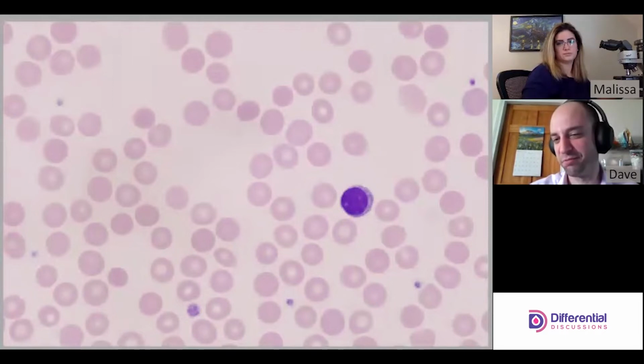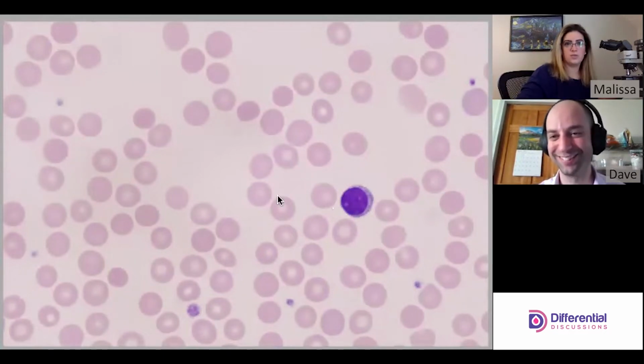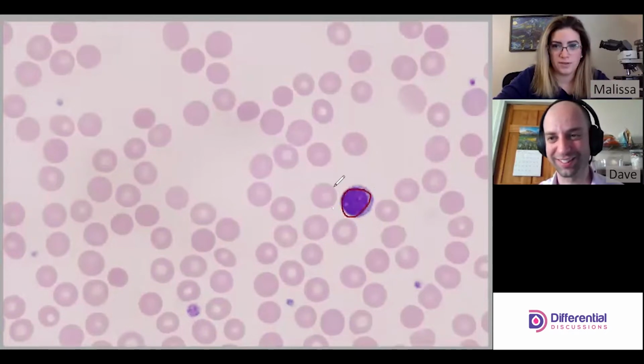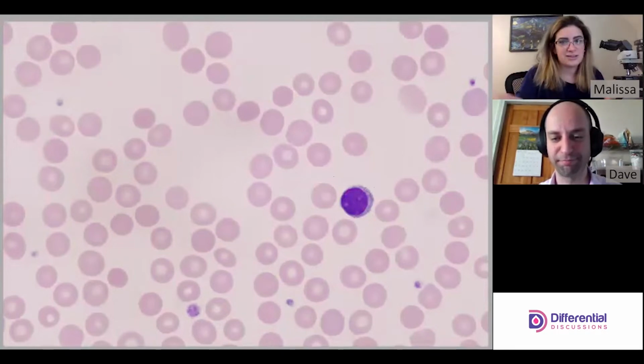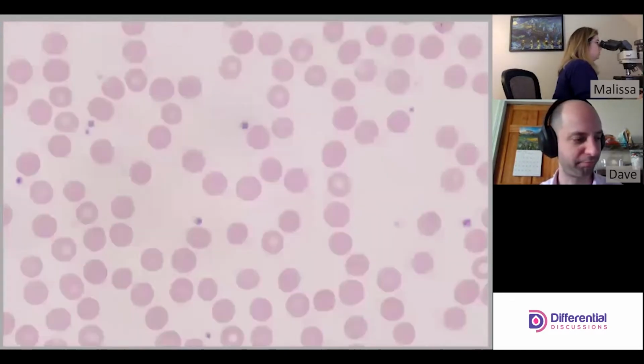And it looks like we got another lymph. This one's really nice because it's right next to that normocytic red cell, so you've got the two right next to one another. My drawing is horrible, I know. Without my drawing, you can see that they're basically the same size, right? So that's how you can tell. It's nice when the cells cooperate. Oh, the other direction.